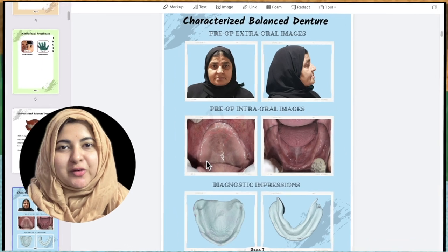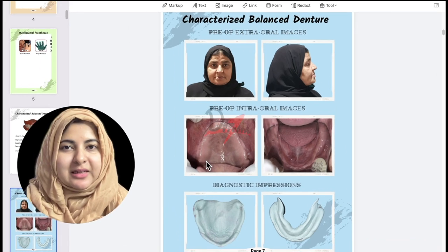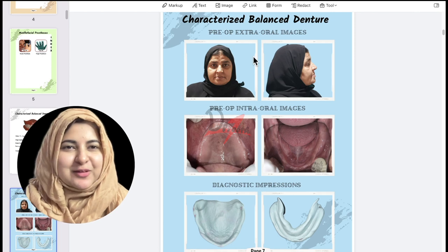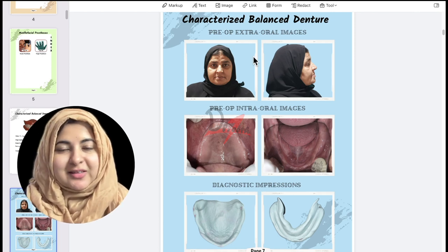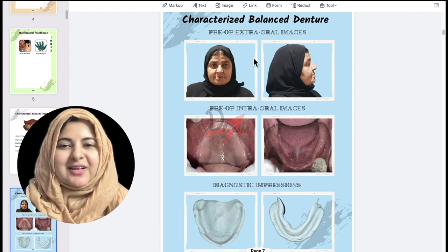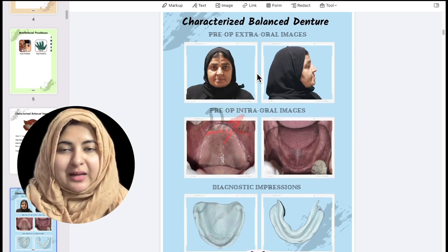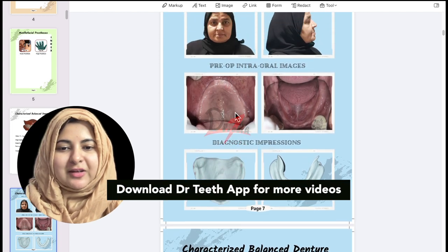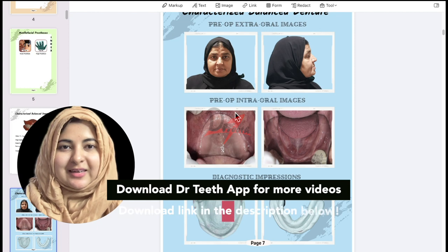Assalamu alaikum everyone. I remember a few of you asking me about the steps of complete denture fabrication. Since I have my album with me now, I thought why not discuss the cases. I'll be starting with the most basic case — the balanced denture — and we'll be going through the steps of complete denture fabrication. This is going to be a new style video, so I hope that you guys like it.